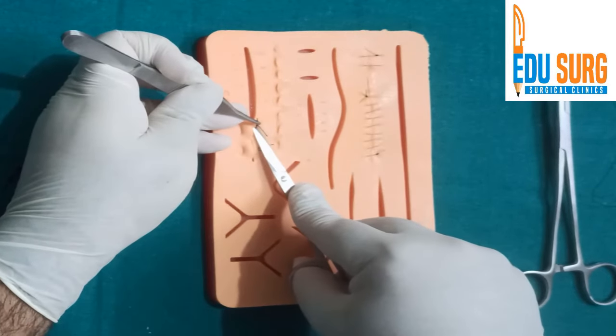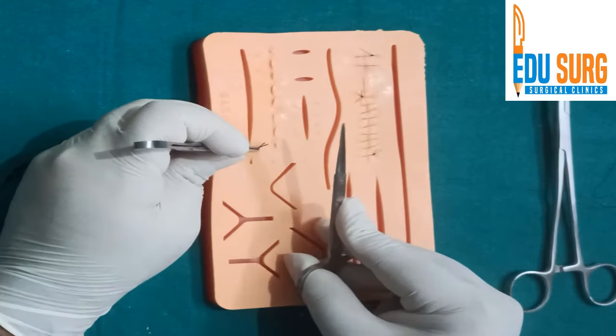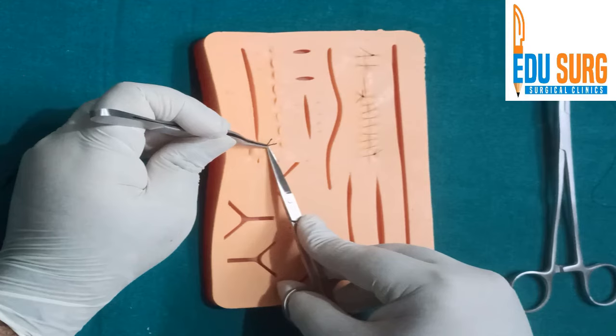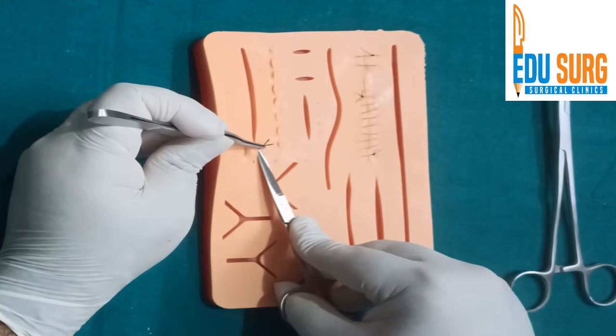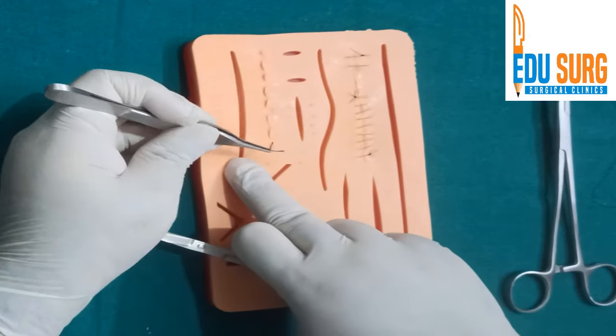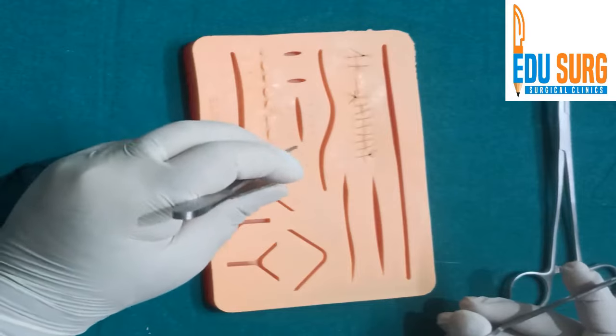Subcuticular stitches are taken with absorbable suture, so they usually do not need removal. When you have taken non-absorbable stitches on the skin, they will need removal. Subcuticular stitches taken with absorbable suture don't need removal. The principle is: hold, pull, cut and remove.